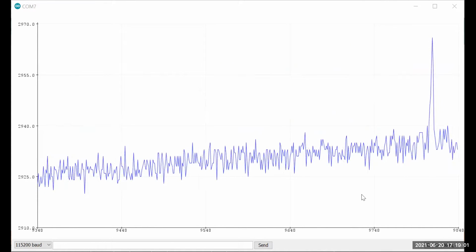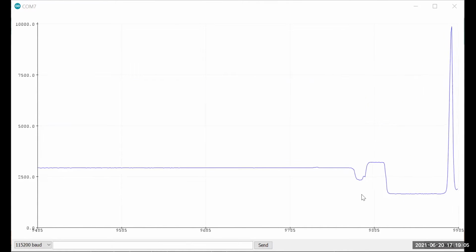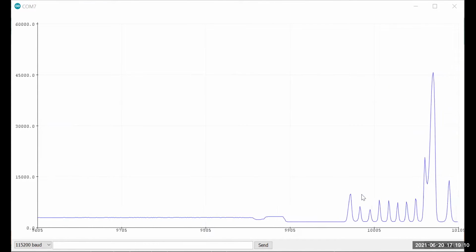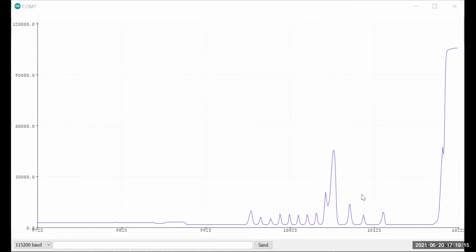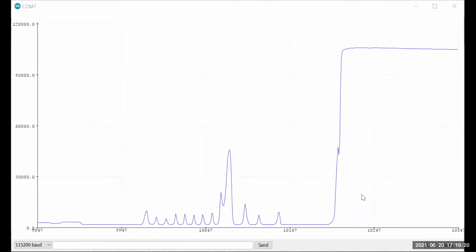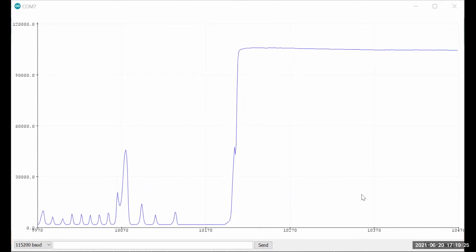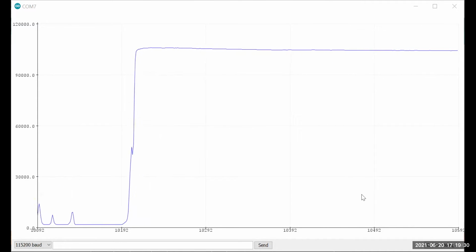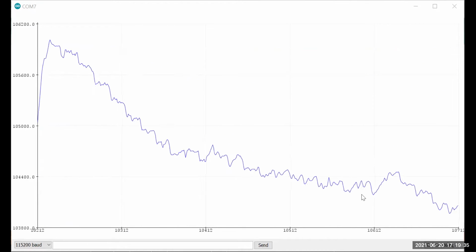Note that since it's solely measuring reflection, if I have my light here, if I just put my finger in the way, you can actually get the sensor to measure different amounts. Note my sample rate's happening so fast, so once I put my finger there, it'll get a very high reflection, and the reflection will change very, very little because my finger's only really changing by a little bit of pressure, and my blood pulse is what I'm trying to measure. I picked a fast rate because see how quickly it's going to the side? It's going to auto scale, and then we're going to see my pulse right there.